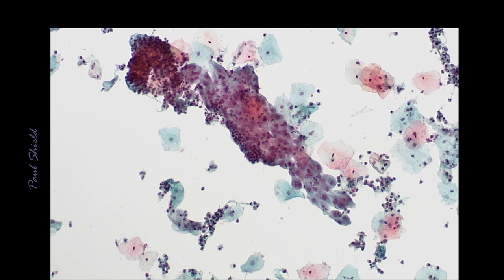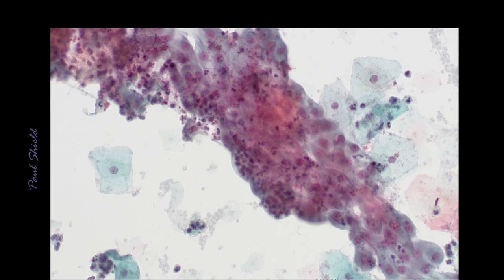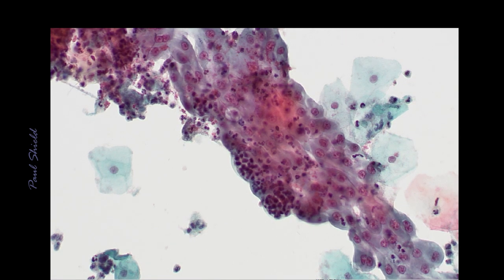We've got a large group of cells which have darker enlarged nuclei. You can see they're forming a fairly cohesive group, and down this end you can see the cells appear squamoid. They've got centrally placed nuclei, fairly dense cytoplasm, and pretty much all the nuclei are in focus at once. So this is quite a flat sheet with a squamous appearance to it. Down here we have really well-defined cell borders and dense cytoplasm like you'd expect in squamous cells.